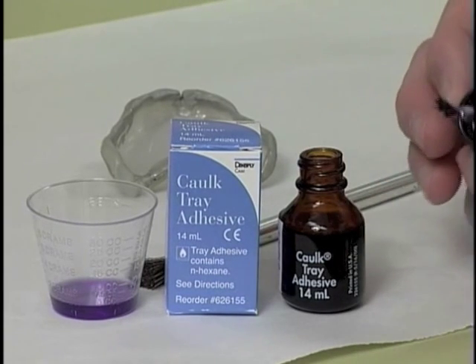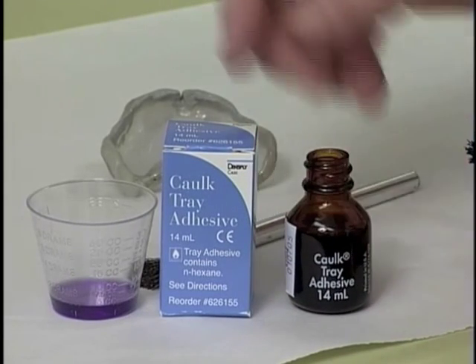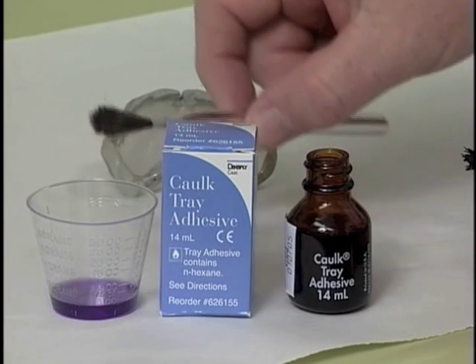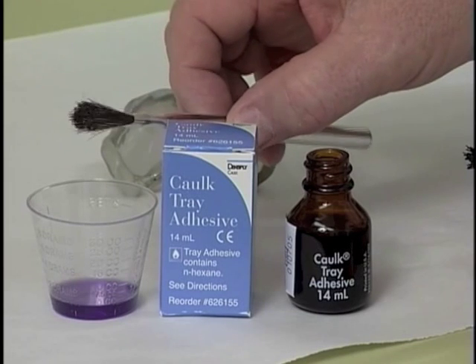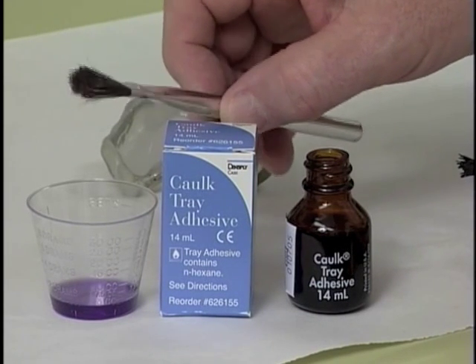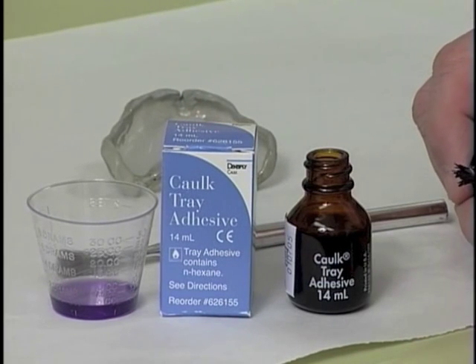So what we do is take the adhesive itself and pour it into a medicine cup and use an acid brush, which is a very cheap type brush, to paint the material into the tray, and that way we can throw that brush away without contaminating any of the material.